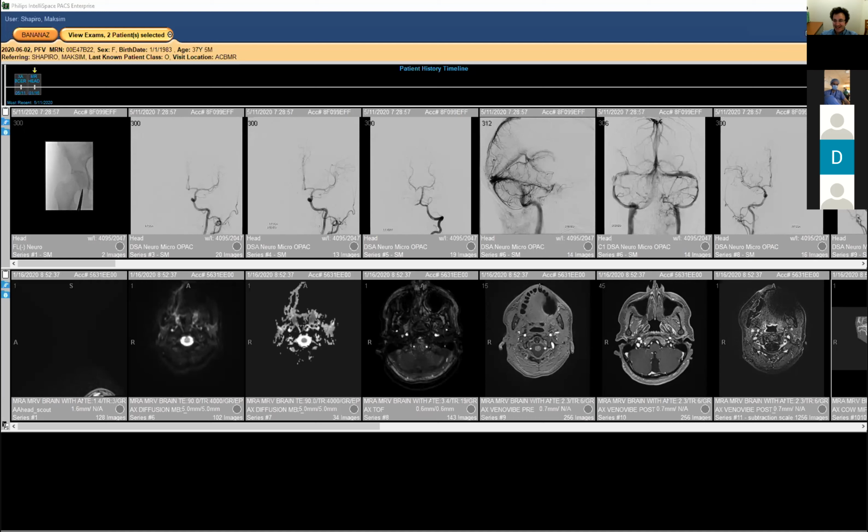I think we need an answer to this, because you're espousing a doctrine here, and it might be that Dodi is correct, that what we're seeing is a meningeal vein capturing a cerebral vein. I'm just not sure. One thing I was going to say as you were going through this lecture is, you're labeling things tentorial sinus as if there is a structure that we occasionally see in a specific location, and that's not true, because they can be anywhere disposed over the tentorium. And that might suggest that it's a meningeal vein that has captured this.